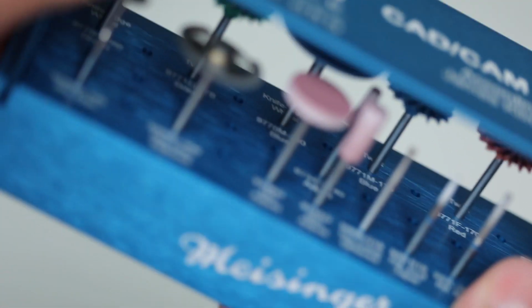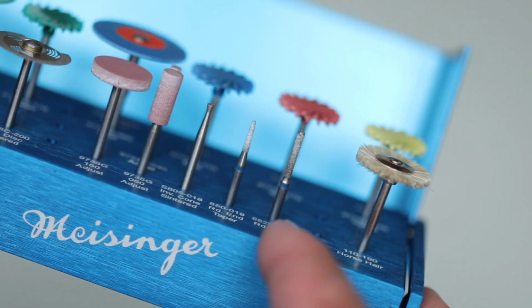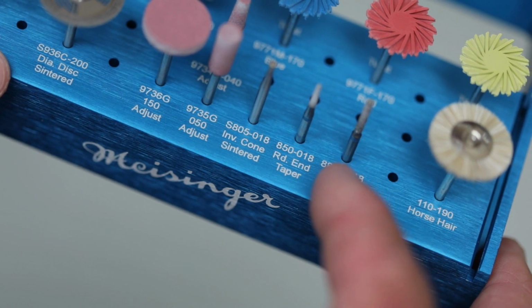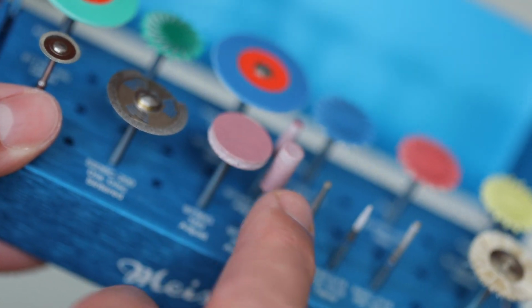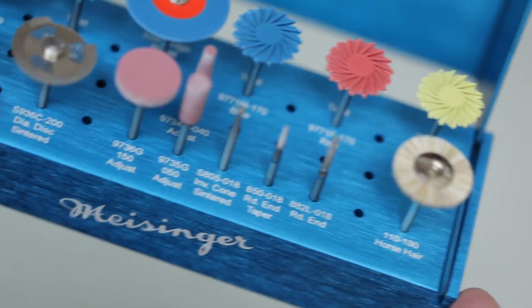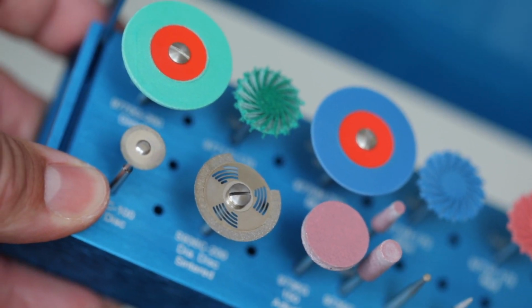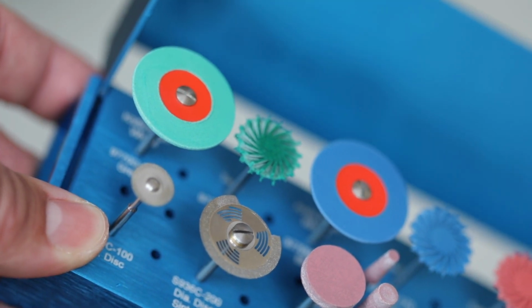It's got everything you need in here to finish and polish your e.max restorations. So I'm going to be using this burr here, this 882L018, to remove the sprue, but I'm also going to use some of these adjustment burrs as well. These will take off porcelain super fast. So I'll probably start with this, and then as I get closer to the part of the crown I want to keep, I'll switch over to one of these to get a little finer contouring of the crown. And then prior to firing the crown, a lot of times with e.max, I'll use these green knife edge wheels and this twist wheel to give a pre-firing polish.